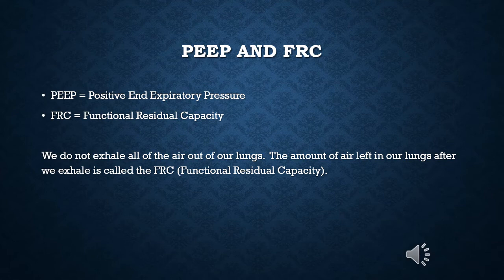And then what you do is you allow the PEEP to maintain what was recruited during the inspiratory phase. Without PEEP, we would be unable to recruit because everything that we open during the inspiratory phase would be totally lost during the expiratory phase. So PEEP is essential in alveolar recruitment, but it does not actually do the recruiting. Now, in 90% of ventilation cases, this just doesn't matter. It's just words. But in the really sick ventilated patients, the ones where we really have to think our way through it, you have to understand the difference.